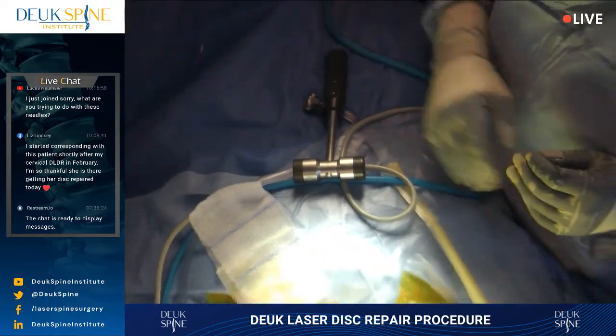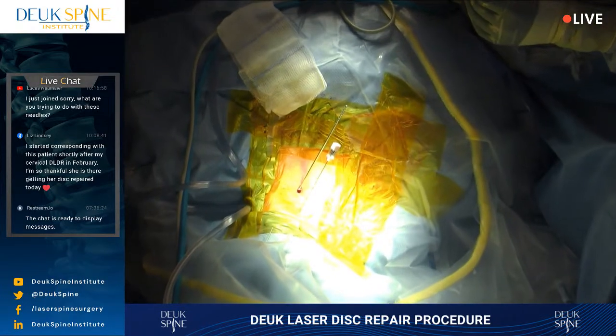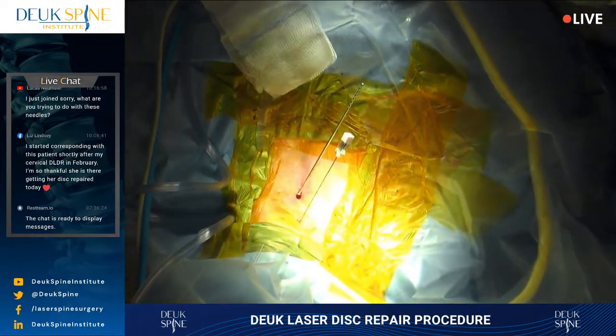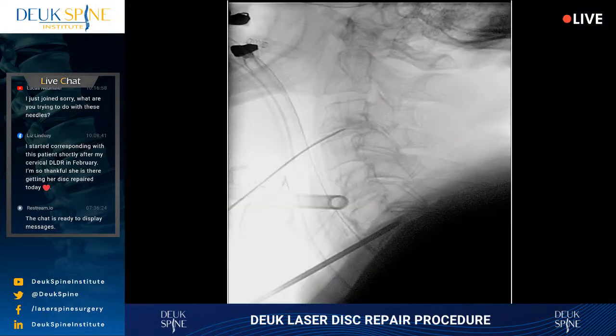We're at the back of the disc. I can see it on the X-ray. We're at the proper level, C6-7, which is the bottom disc we're going to do. And now we're going to do the entire surgery through this tiny metal tube, folks. This is a Deuk laser disc repair.